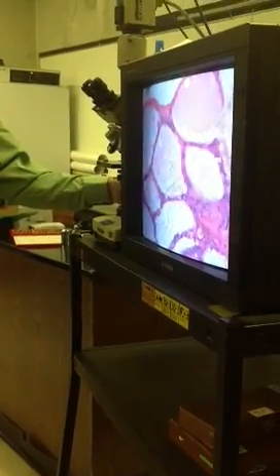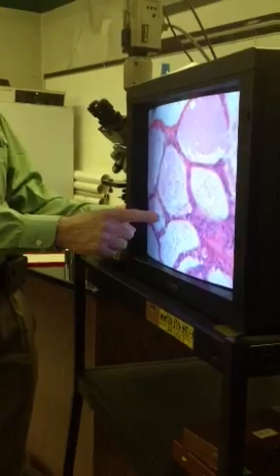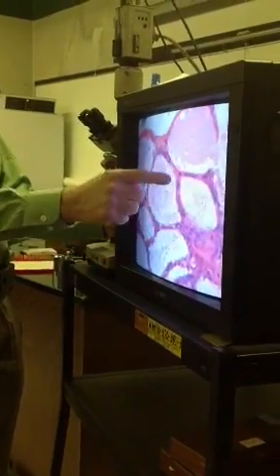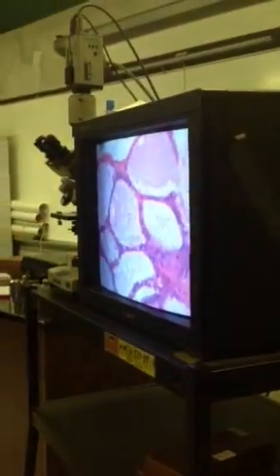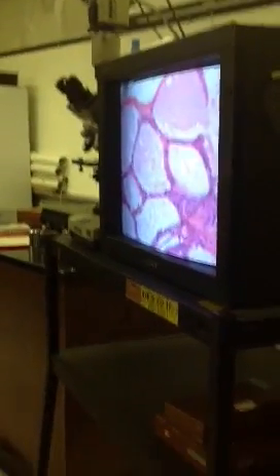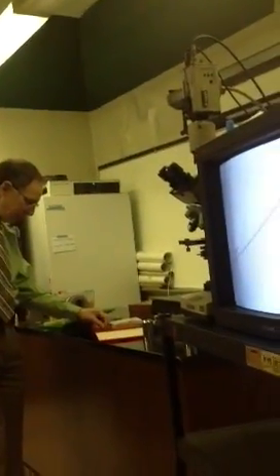And also, in terms of cells and staining, you'll notice that there are these chromophobic cells variously around here, which are the myoepithelial cells. So anyway, that's lactating breast. Again, a lot of these tissues, it's clear that it helps to identify them by what you might find or not find in the lumen. And I will always try and find something that gives you that characteristic.